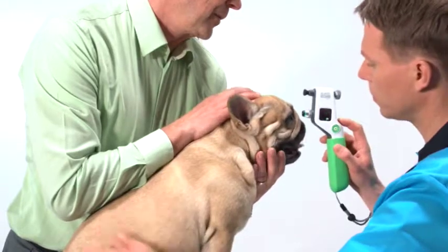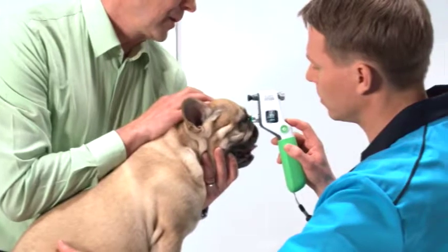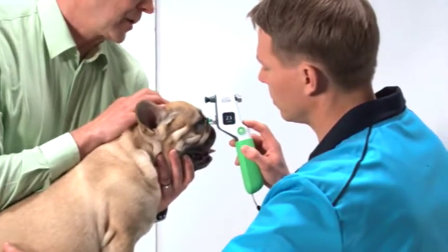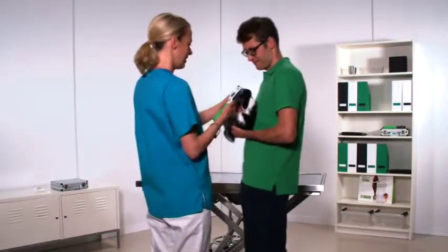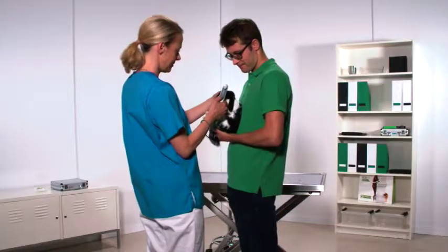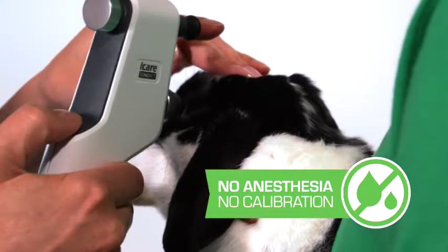The new device still utilizes our patented rebound technology, where a small probe lightly touches the cornea to measure intraocular pressure, or IOP. This technique is so gentle that it requires no topical anesthetic, nor does this device need to be calibrated.